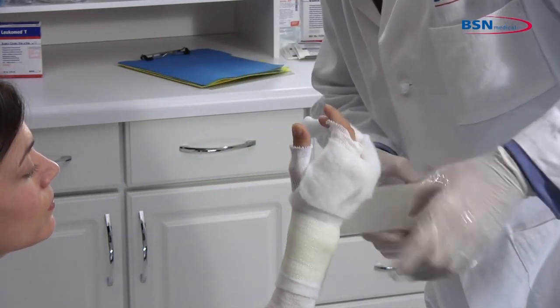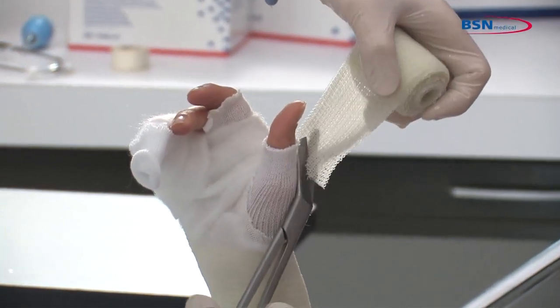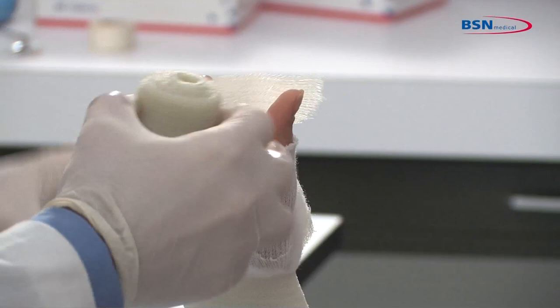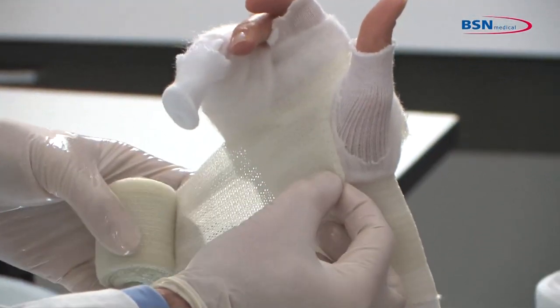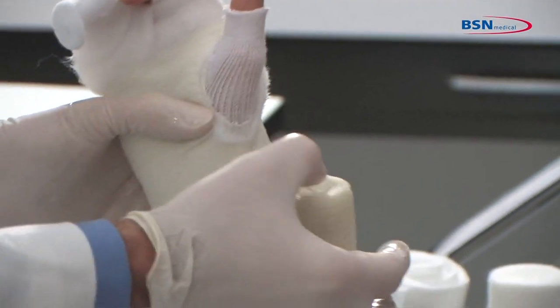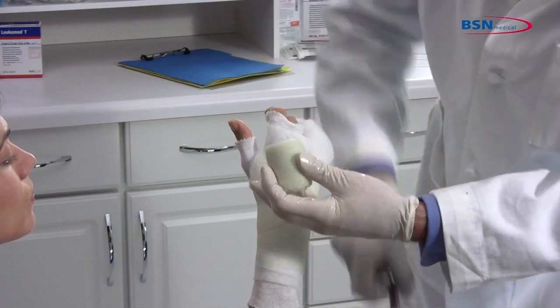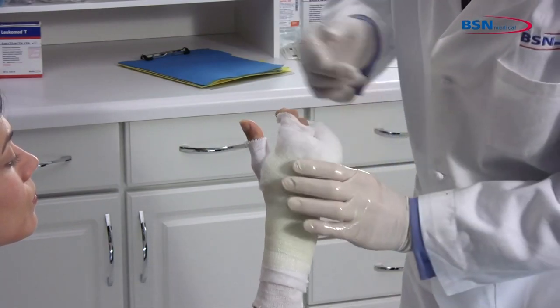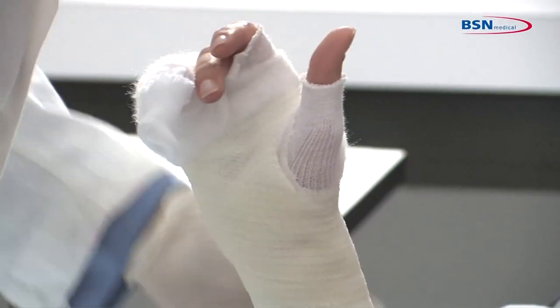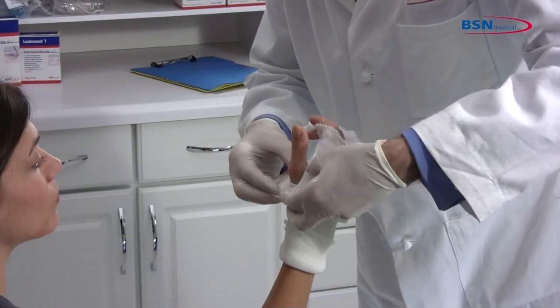Start wrapping the cast tape below the wrist, working distally to the hand. Make a cut at the thumb to easily pass through the web space. Curl the cut edges of the cast tape under to create a smoother edge, then work proximally to the wrist. Fold back stockinette for protection of the skin and soft edge.